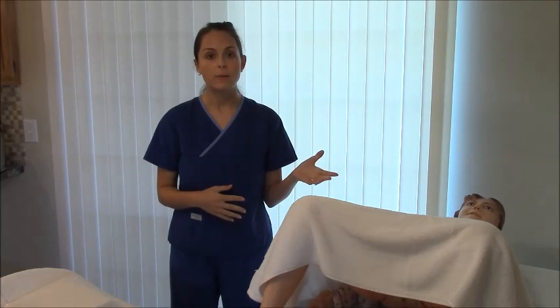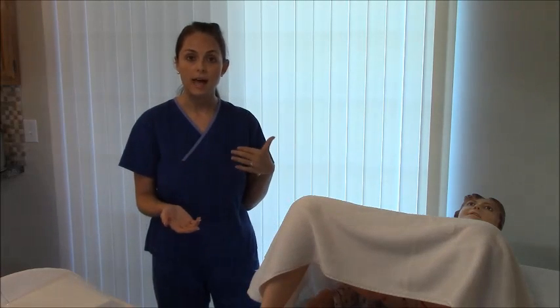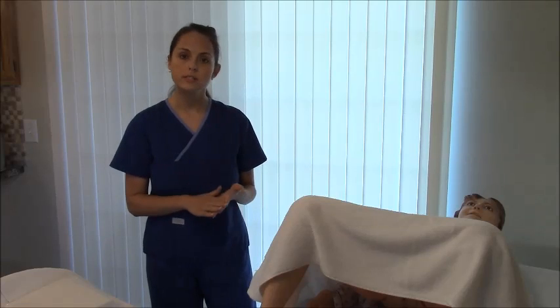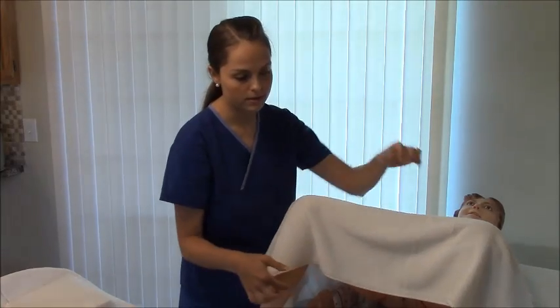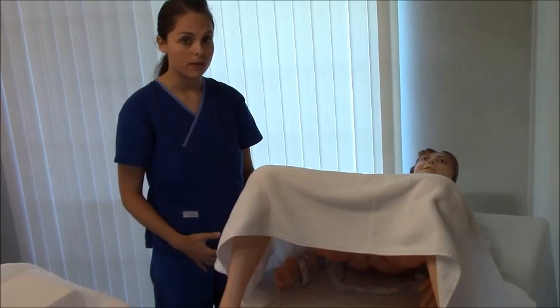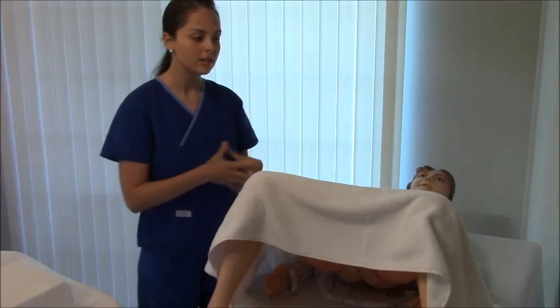After educating your patient, get your Foley kit and do hand hygiene. Then get your patient in position. It's a good idea to have another person in the room — a nursing assistant or fellow nurse — just because of the nature of the procedure. For females, get them in position with the legs up, and try to preserve modesty as much as you can. A lot of people are modest and this is an embarrassing position, so try to make them feel as comfortable as possible.